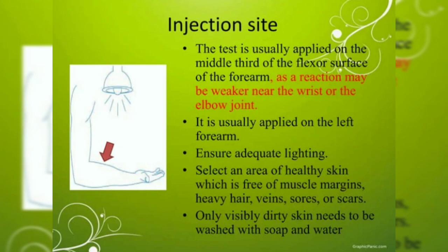Ensure adequate light. Select an area of healthy skin which is free of muscle margins, heavy hair, veins, sores or scars. Only visibly dirty skin needs to be washed with soap and water.